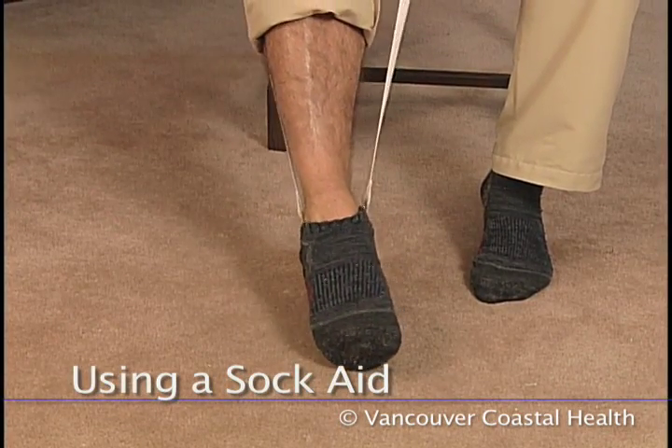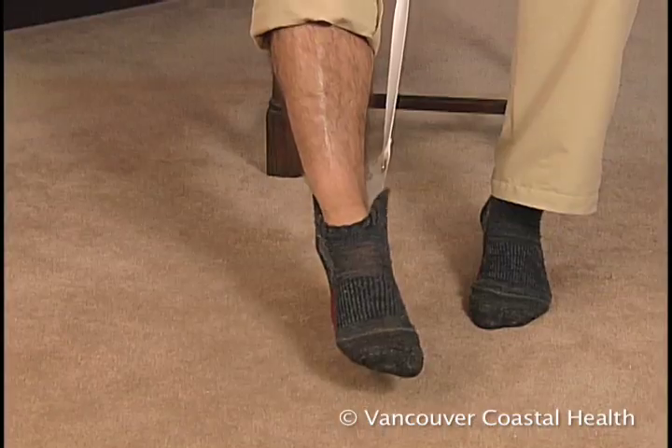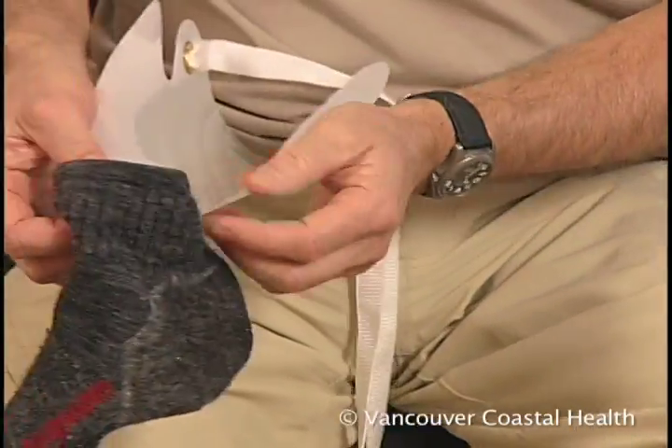Using an aid to put on socks is required for three months after hip surgery and can be very useful after knee surgery.